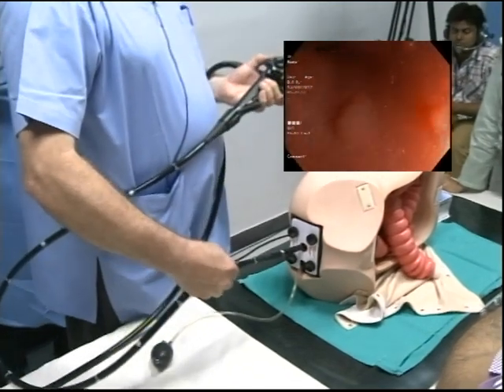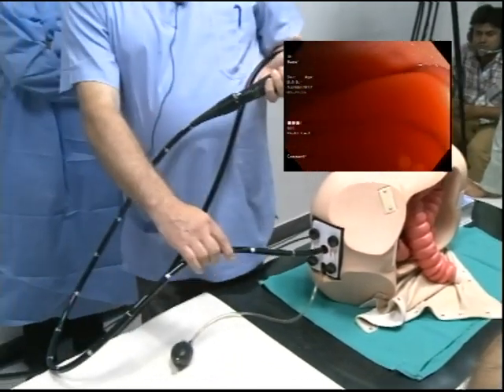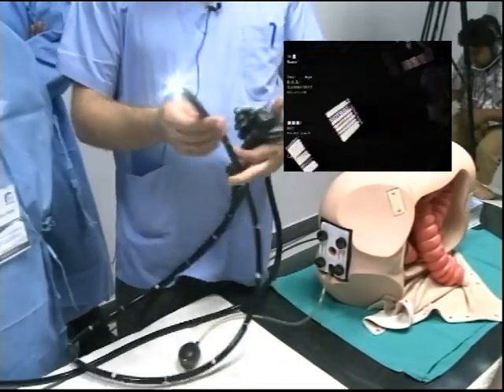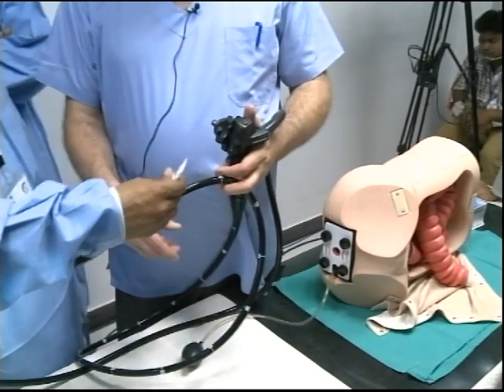This is quite dry, this, my friend. Any lubricant whatsoever for the scope, boss, because that is so dry. Okay. Lubricant. Yeah.